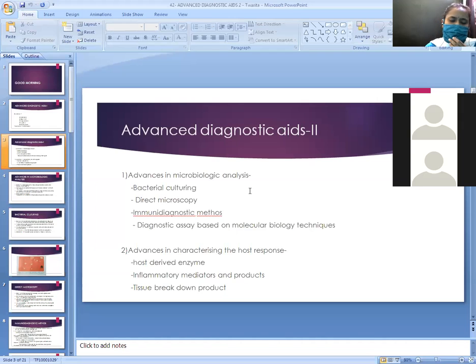So, for that purpose of diagnosis and advancement, first is clinical advancement, or advancement in clinical diagnostic aids, which we have seen in probing. Secondly, advancement in radiographic diagnosis. So in radiographic diagnosis, there are different ways you people have seen in the conservative department. So how in the conservative department radiographs are taken with the help of RVG. You people know it very well, I think.